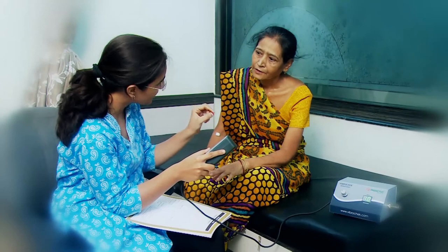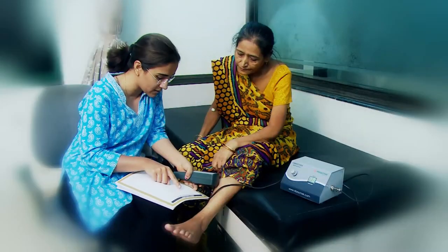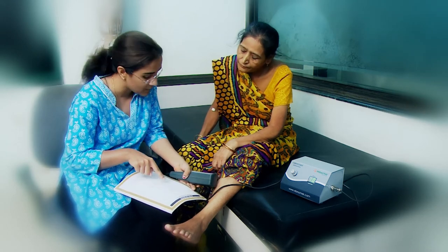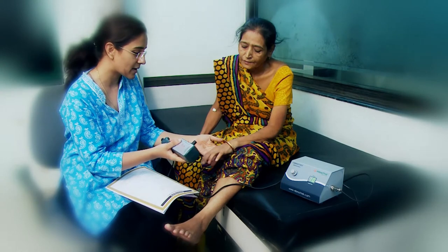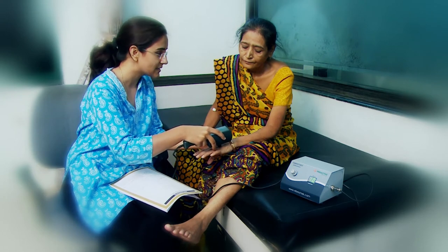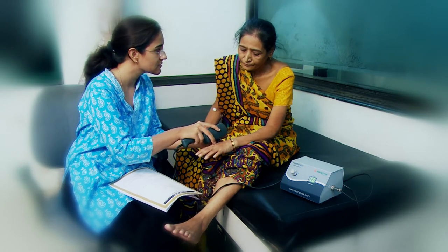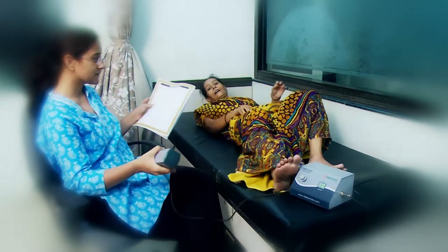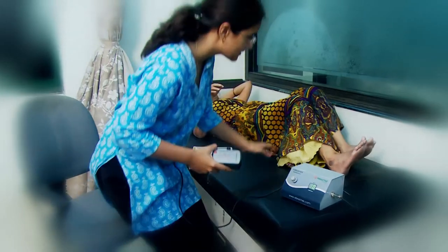Testing preparation: Enable the patient to lie down in a supine position. Explain that you will be testing vibration sensation in their feet at various points and they will be sensing each vibration. Now apply the probe located under the handle to the patient's hand and let the patient feel the vibrations clearly by keeping the threshold point at V4 or V5. This will acclimatize the patient to the sensation. Brief them to respond loudly by feeling the sensation and then stating yes or no loudly.